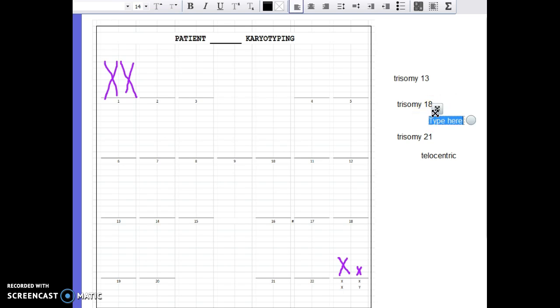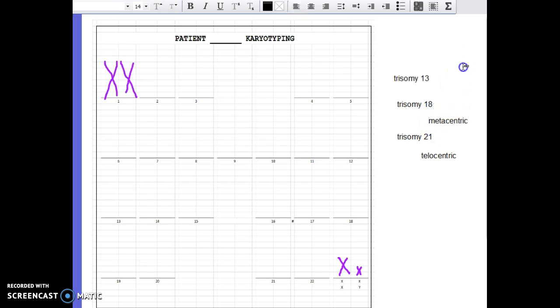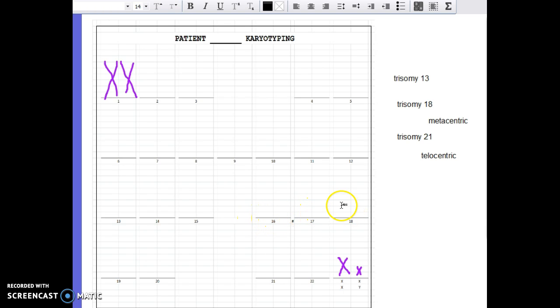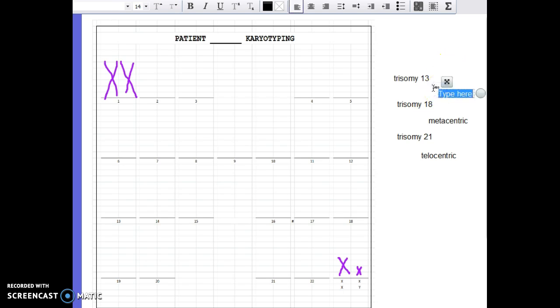Trisomy 18 is a metacentric chromosome. So when you get to a karyotype and you have three chromosomes and they are metacentric and they're not an X chromosome or a Y chromosome, then you can likely guess that you have a trisomy 18. So that means put it on the 18th chromosome. It may be very similar in size to 17, but make sure if you have the disorder that it goes on one of the given disorders.